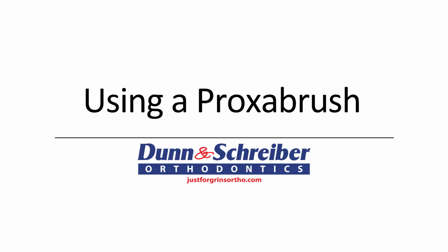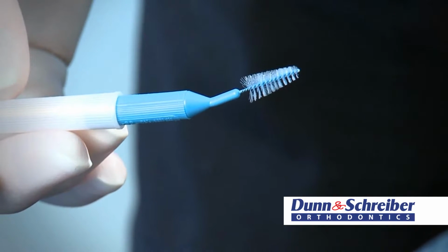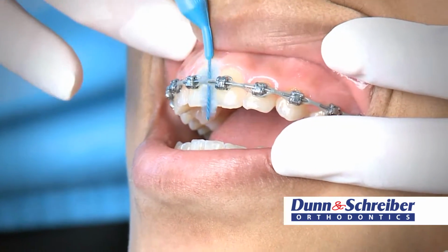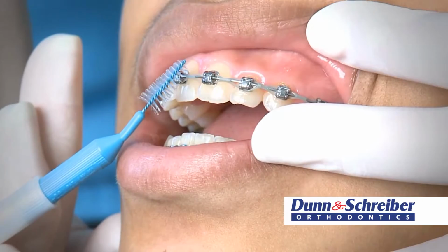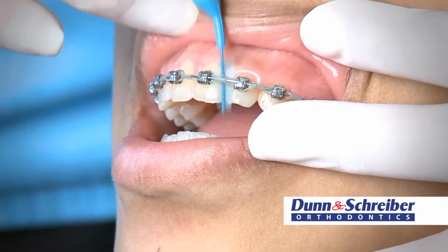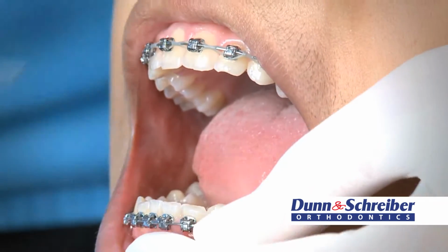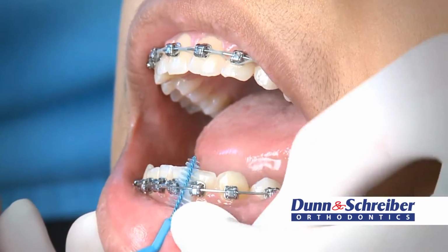Next, let's talk about your proxy brush. You can use it between the arch wire and the braces to help loosen food particles, remove plaque, and stimulate your gums. To use it, just push the brush gently under the arch wire between the brackets. Now, if it's hard to push the brush into an area, don't try to force it, because you might accidentally break a bracket. So only use it in those areas where you can be sure to use it gently.